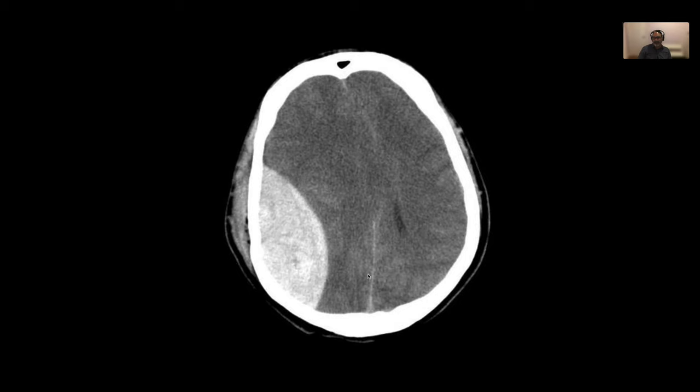And you will see a midline shift also. But yeah, absolutely. So history of trauma. And if it looks like this, extradural hemorrhage, it has to be decompressed. So you can actually drill a hole in the skull and you can decompress this. But if it's a subarachnoid bleed or intracerebral, you can't, because that bleed is inside the dura. For that, even if you drill a hole, you will have to make a hole into the dura. I'll explain that in a second. But if it looks like that, extradural, always. Okay, and feel free to Google them. You'll see a lot of them looking like that. We'll see a few more here also.